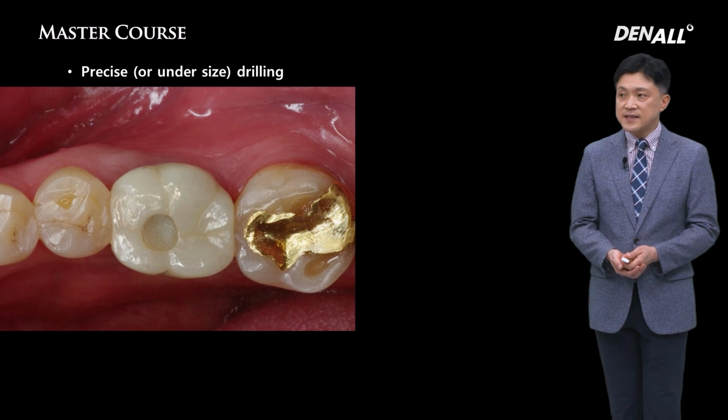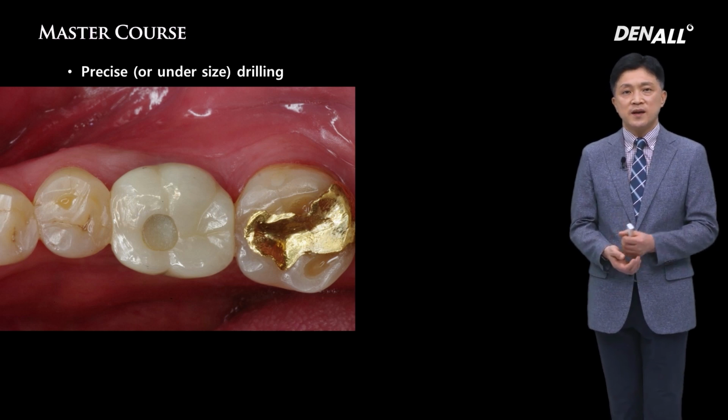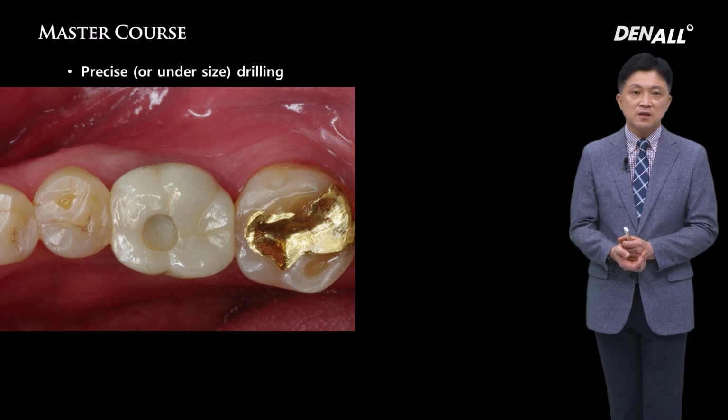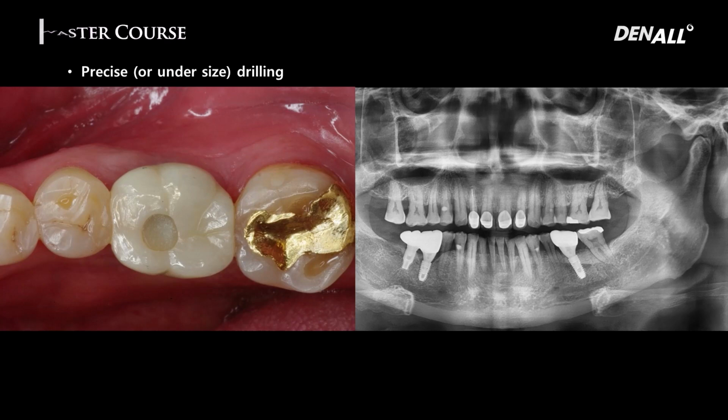As for prosthesis, I wait approximately 16 weeks. I wait longer before I do loading. So I believe from week 12, loading may be possible. Prosthesis has been delivered, and this is follow-up.